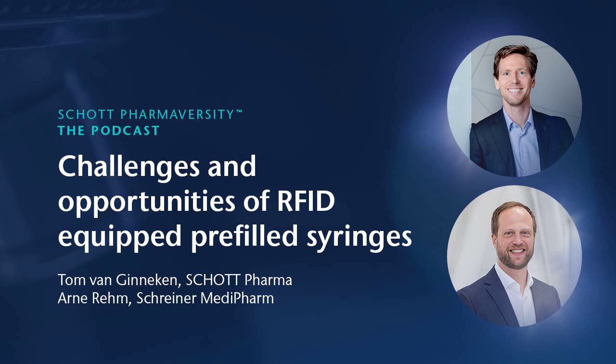So in reality, it's even more complex as we have to deal with a large number of different liquids, fill levels, container sizes. So you have a product line from 1 ml to 50 ml syringes, which is quite a big difference in volume of liquids. So this makes it really, really complex.